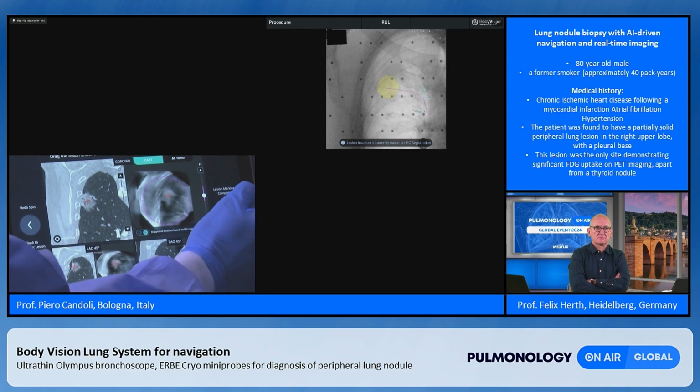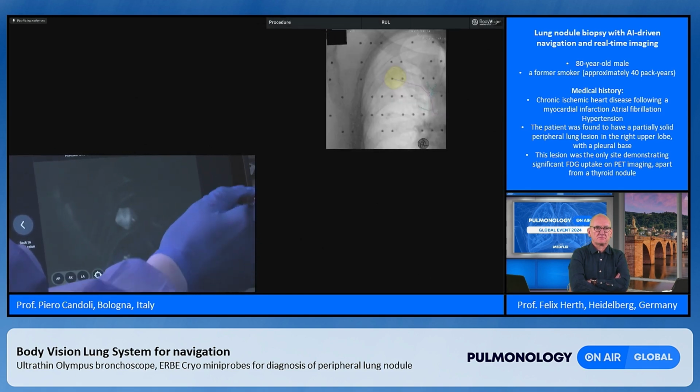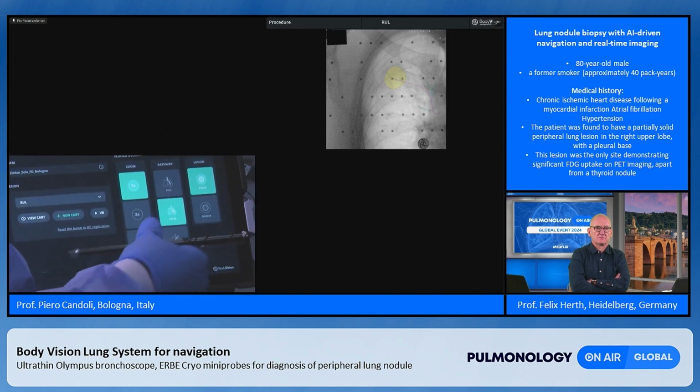Okay. Yes. And now the pre-procedural phase is over. And we can start the bronchoscopy.